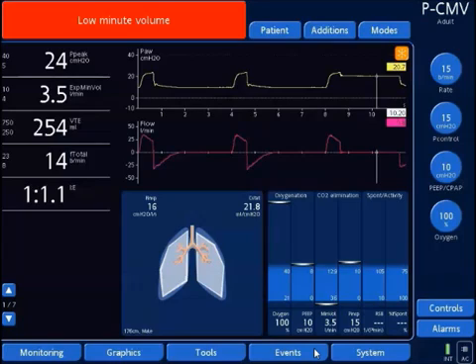Before showing how to obtain plateau pressures with various modes, I'm going to provide an overview of the ventilator screen if you're unfamiliar with it. This model, the G5. So just follow my cursor. Here's my cursor. This screen's broken down into sections. Over here are all measured values. These are my diagnostic waveforms, and we're going to specifically look at this pressure waveform in yellow.